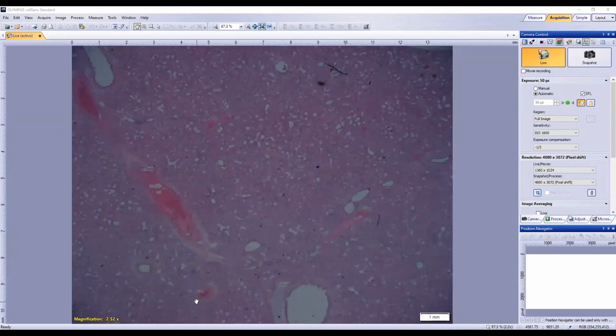If we're doing a really, really detailed description of this abscess, then our final layer is further surrounded by, if it's really mature, fibrocytes with fewer fibroblasts and collagen fibers. So perfect, we've successfully described the thing that's not here. Yeah, and then maturing granulation tissue as well. Absolutely. Cool, that's really good. So now that we've got a good picture of our Rhodococcus lung, we're confident that that's not what this is.